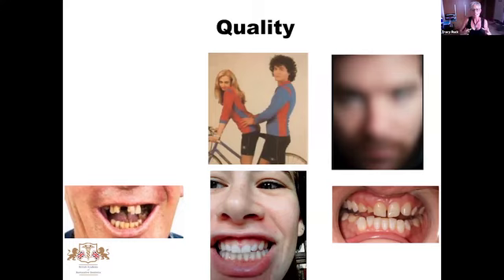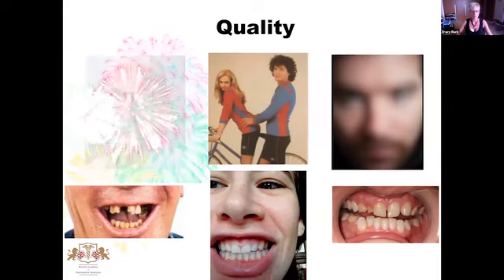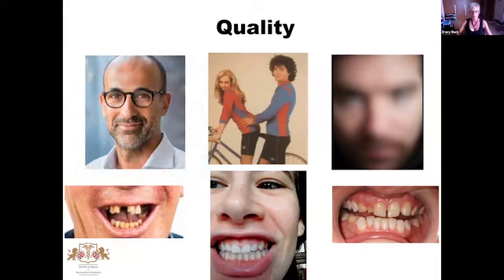So it's exactly the same. When the patient's buying into the new smile, they want to see how the teeth are fitting into the whole head, okay? So think about that and get the full headshot photo for imaging. So you might think this is the perfect shot then for imaging. Full headshot of this gentleman in focus, eyes open, you know, and nice smiling face. But obviously we can't see his teeth.